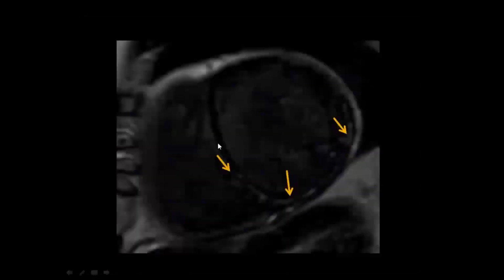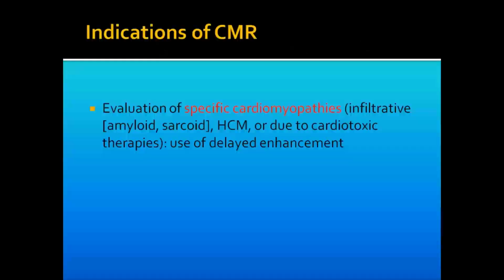This is the viability, or delayed hyperenhancement. As you see here, there's a mid-wall enhancement. That means the patient has now developed the final stage of ischemic dilated cardiomyopathy. And look at the thickness of the myocardium. It's less than 5 millimeters. So this patient actually has burnt myocardium. Do you think CABG will help him now? 17%, dilated cardiomyopathy, end stage. So actually, the surgeon refused to do the CABG, and he asked for an ICD and optimizing medical treatment.